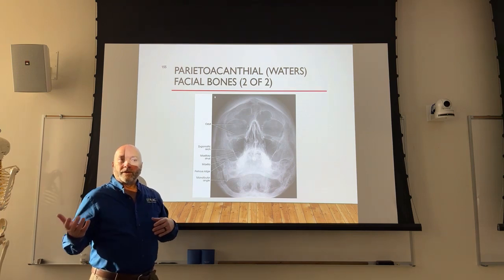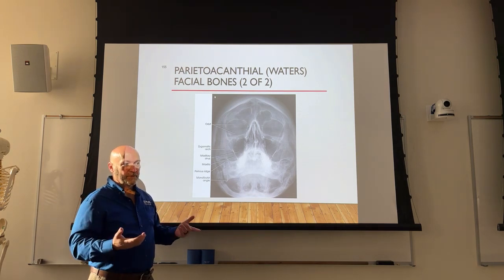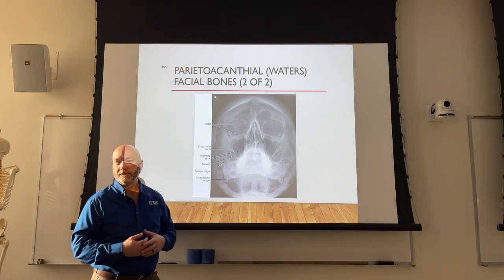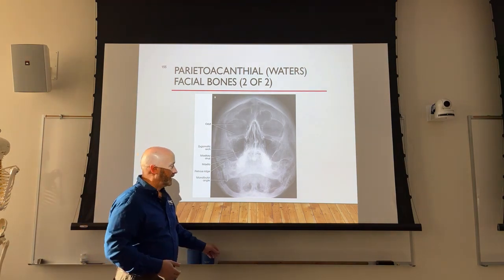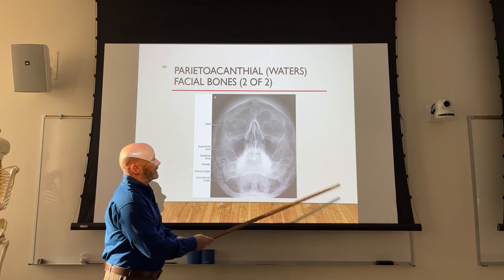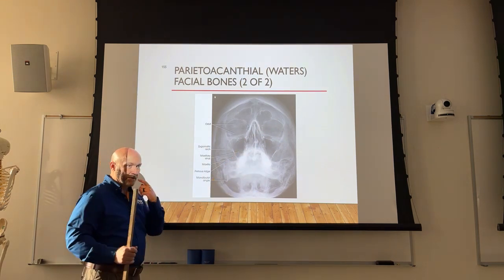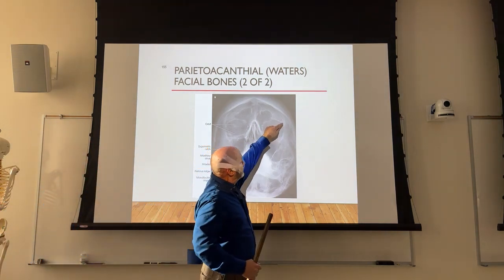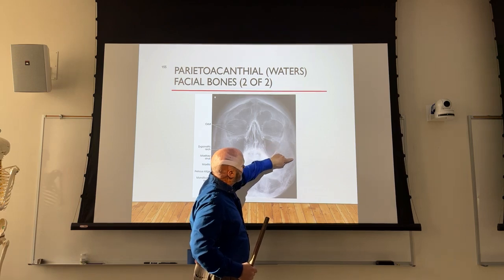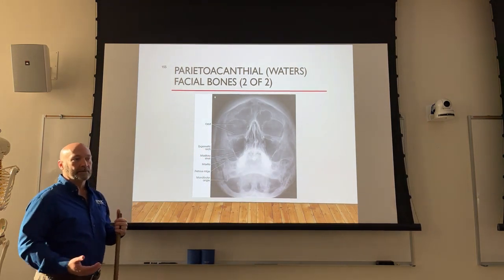It's also like when we were in spines and we talked about the Scotty dog, y'all remember that? Some of you looked at it and said, I don't see that at all, and some of you kind of saw it, right? Well, it's kind of the same thing here. Think of a zoo animal that has a great big ear. What does that zoo animal also have that has a massive ear? Trunk, right. So, forehead, see this thing coming out here? Can you kind of make out how that's a little bit of a trunk? Okay, that's a zygomatic process.